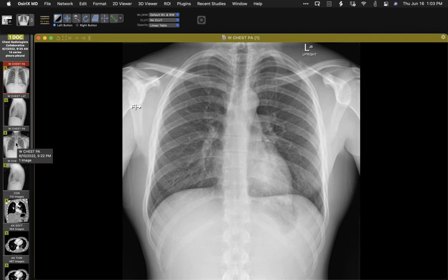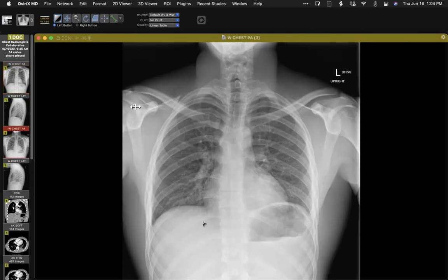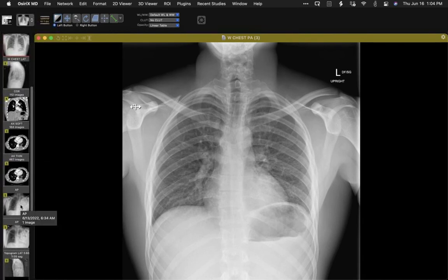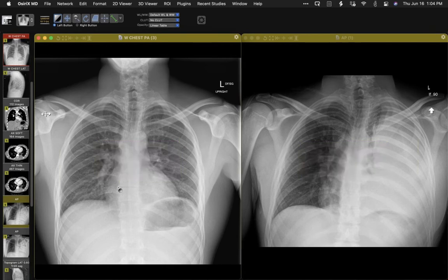Going forward to June 10th, inflation of the lungs is less, and it's really hard to determine whether it has changed or what might be going on there. The time interval between these two images is three days, and we have a substantial accumulation of left pleural fluid in that period. That's the dominant finding.